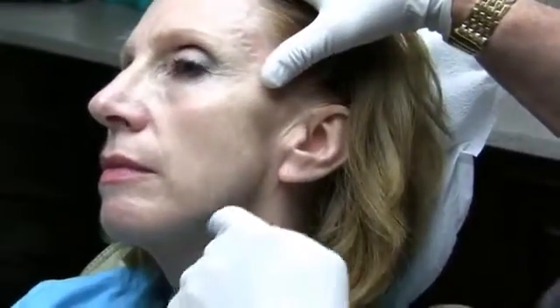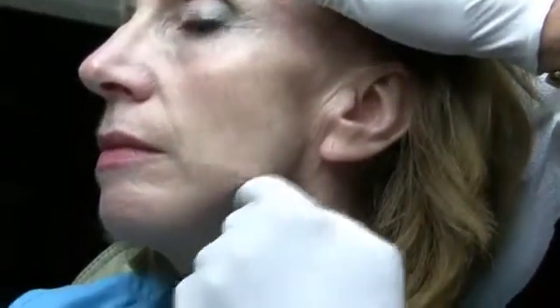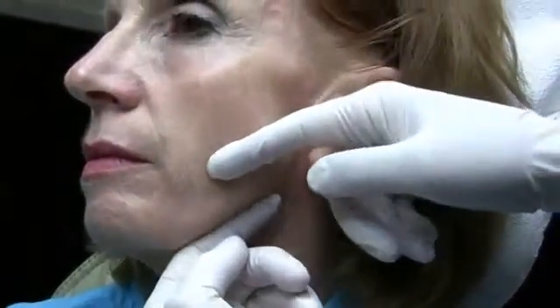Lucy, our friend here, has some interesting filler challenges. She's had some skeletal maxillofacial surgery in the past, and she has a defect here, which is not uncommon. There's numerous ways to treat this, but today we're going to put some filler in there. So we're going to use a large particle thick filler.